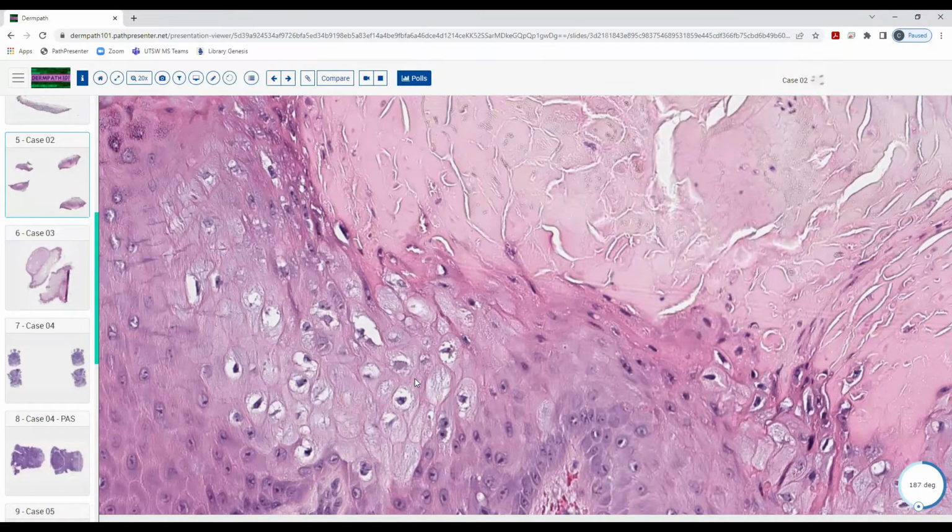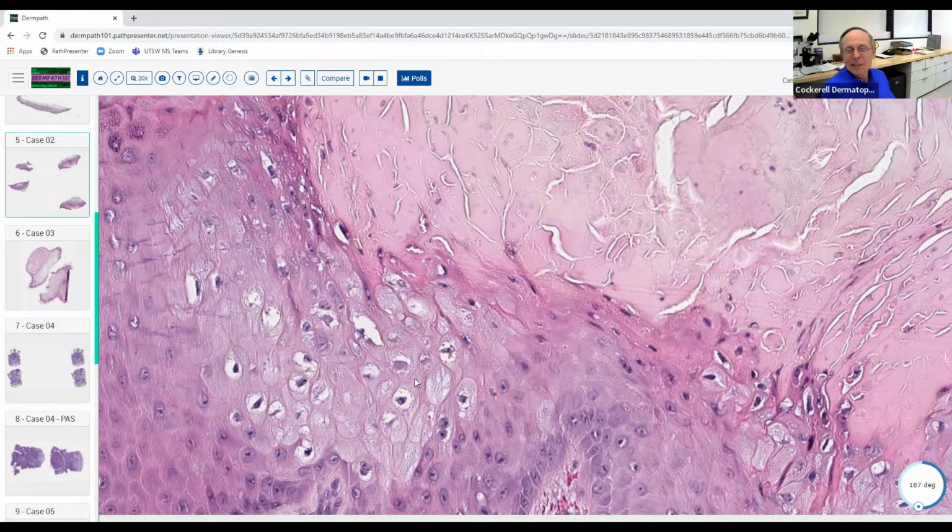It doesn't really make that eschar, unless you're a severely immunocompromised patient and get a syncytium of multinucleated giant cells, and they can do that sometimes. But those cells, number one, are not multinucleated. These are just ballooned, large, swollen cells, and they're not acantholytic. So with herpes, the cells fall apart. That's why you can do a Tzanck preparation, for example. So this is a different kind of viral process.